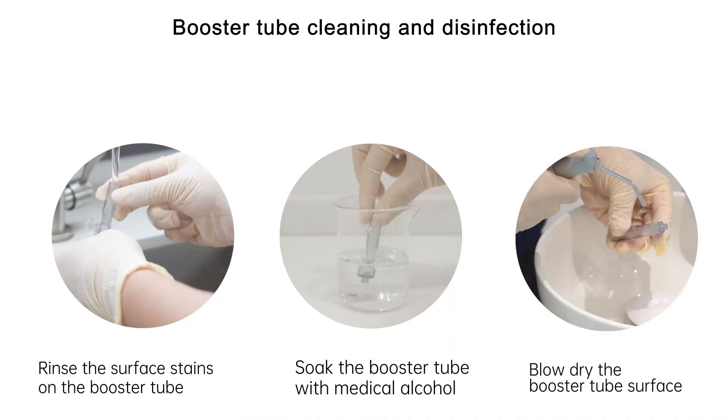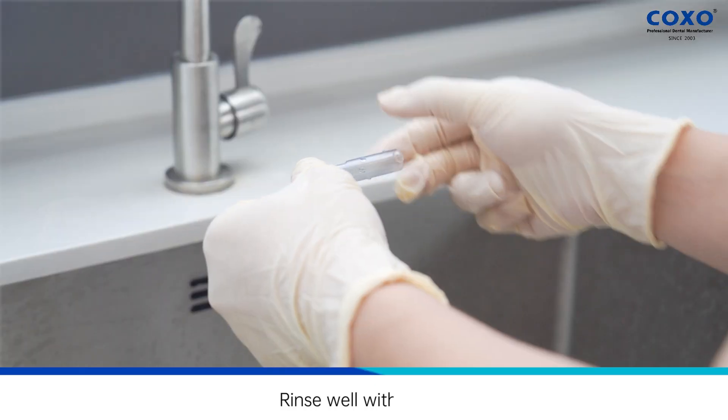Booster tube cleaning and disinfection. Rinse the surface stains on the booster tube. Soak the booster tube with medical alcohol. Blow dry the booster tube surface. Rinse well with water.